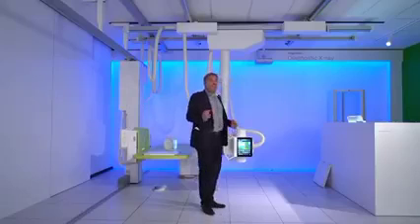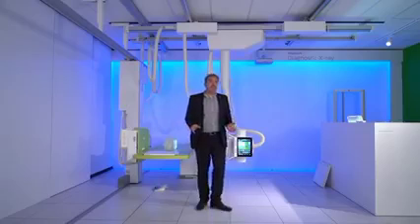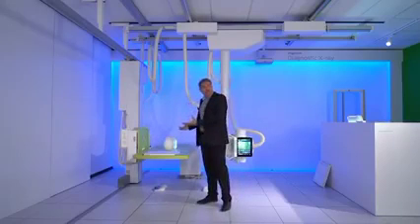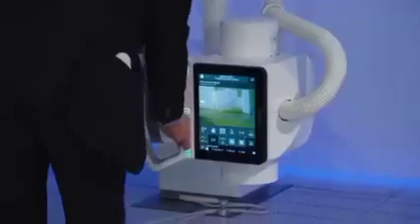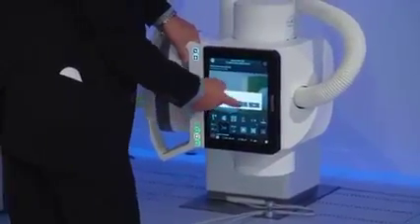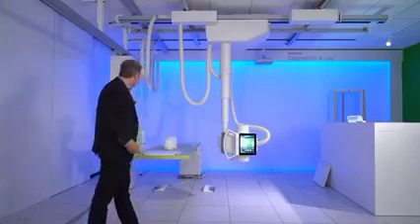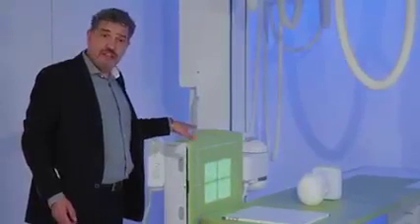Rather than making those lateral exposures with a wireless detector and manual technique, it's much better to pay more attention to your patient, focus on the patient, and just move the system anywhere you need. Press a button again on this lever tube head, and the system again will automatically align to any position that is possible and needed.